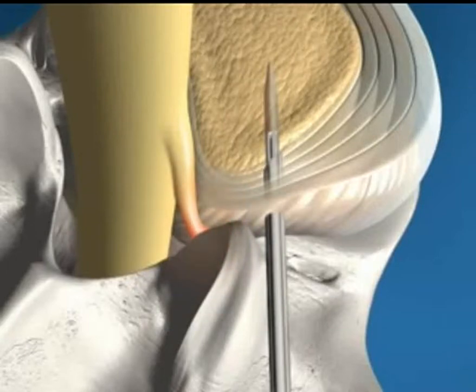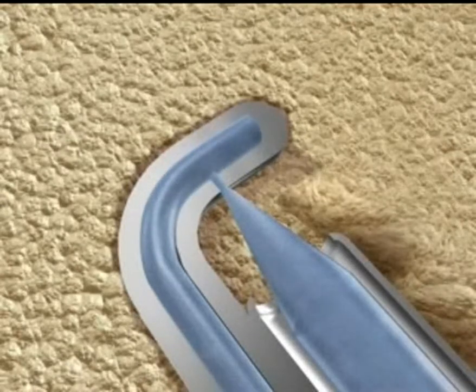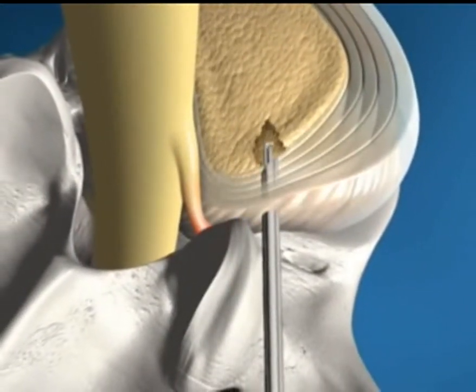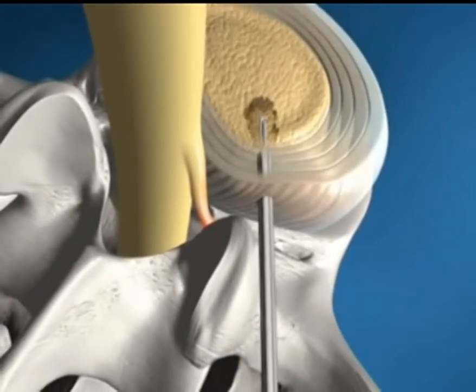The Micro-Resector is inserted into the disc space through the cannula. The unique SpineJet Micro-Resector uses a high velocity stream of sterile saline to quickly and safely resect and aspirate a small portion of the nucleus. Proper technique requires pistoning, rotating, and fanning of the Micro-Resector for approximately three minutes.